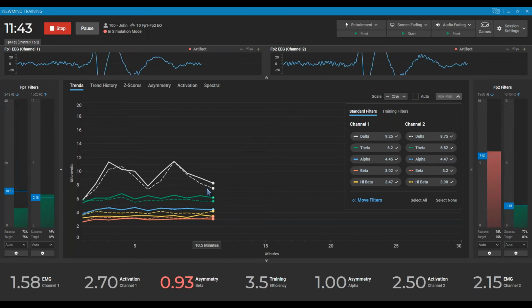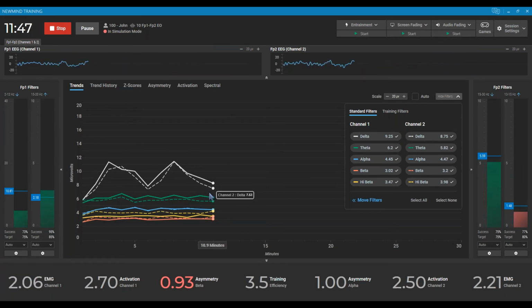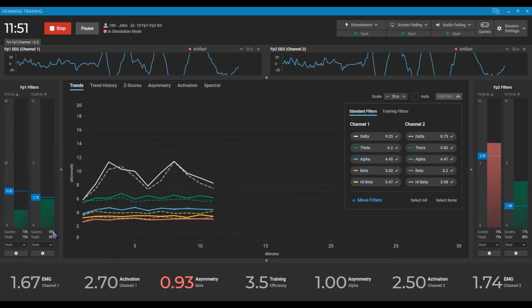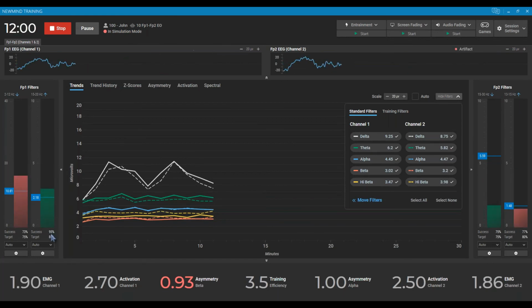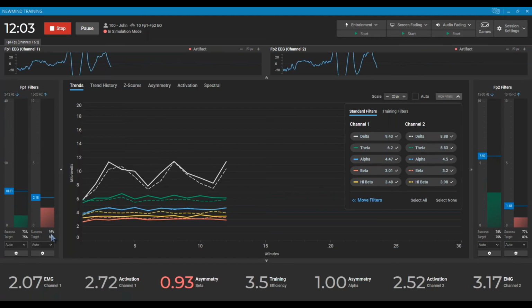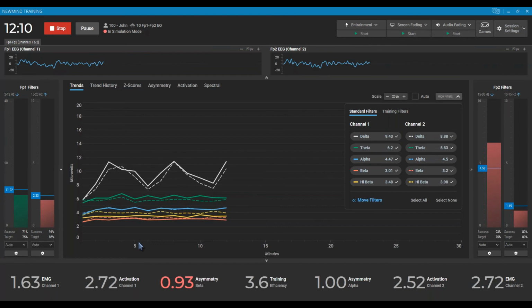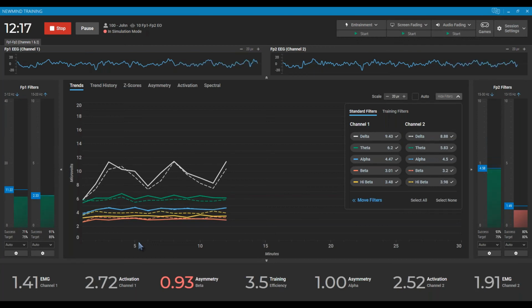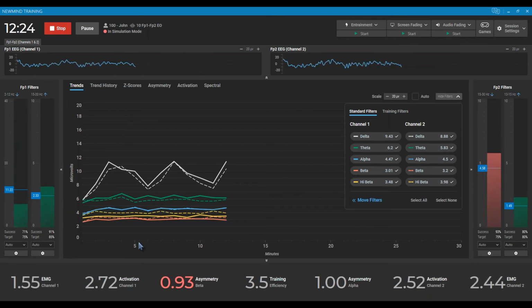So now you can see here after we moved that target percentage back up to 85, we gave it a few minutes to pull in, average some more data. Now we've got them up to a 95% success rate. So, yeah, what I do, Aaron, is I start most people off at 85 in their first few sessions because I want them to succeed. I want them to get something and succeed and not work them too hard. And then once I'm watching those success rates and those thresholds staying where they're supposed to be, when it's up at 90 and it's set at 85, then I'm going to be taking it down to 80. And eventually I work everybody down to 70 or 75. But I always start easy to make sure they have some success with their first session and not work them too hard. But that's just a preference.